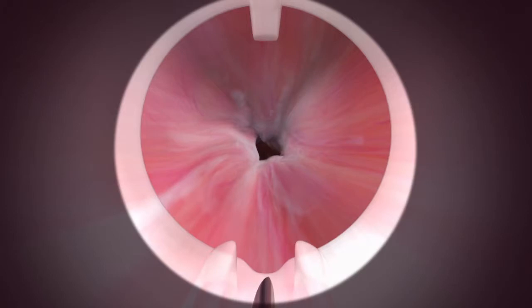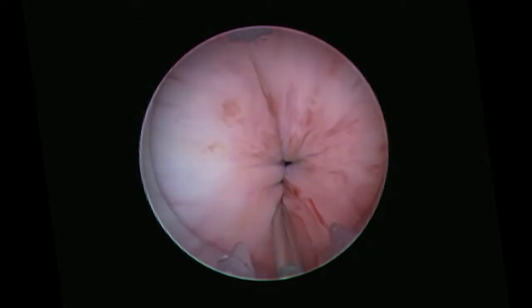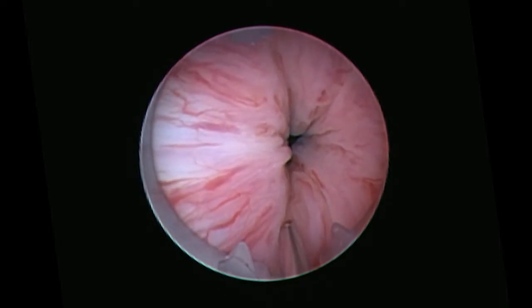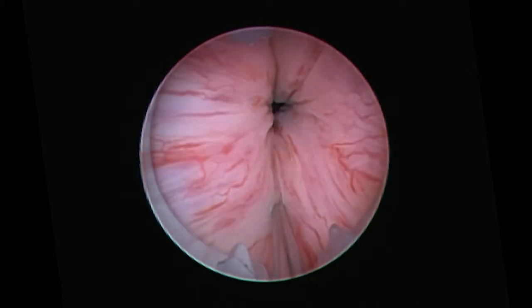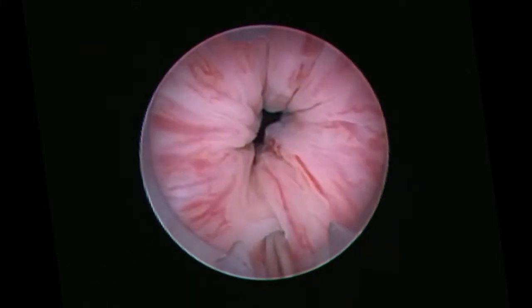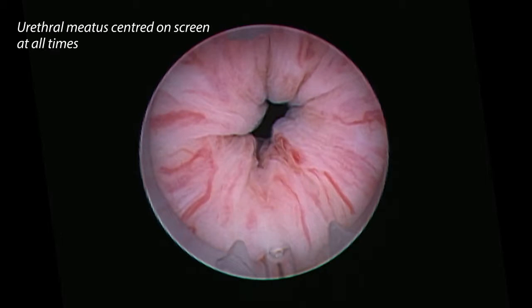Maintain the position of the needle tip adjacent to the bladder neck and fully retract the rotatable sheath over the needle. Retract the needle distally into the rotatable sheath, taking care to maintain the position of the Bulkamid system in the urethra. Gently press the Bulkamid system parallel against the urethral wall until mucosa appears in front of the needle tip. The bevel of the needle should be facing towards the center of the lumen at all times. To avoid angulation of the system, ensure the urethral meatus is centered on the screen throughout the procedure.